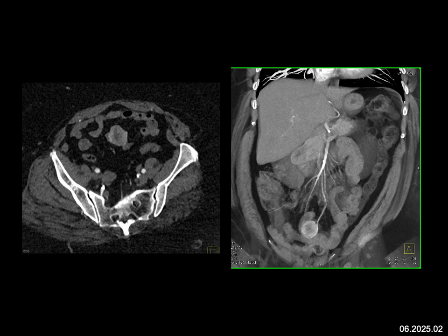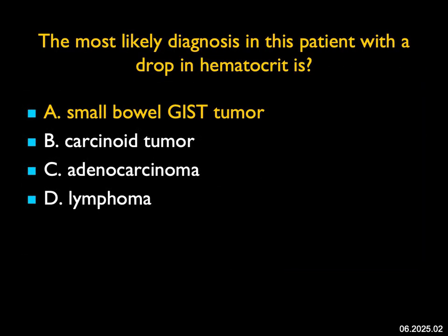Adenocarcinoma is just too vascular for an adeno CA. Lymphoma can give masses in the mesentery, but usually they're large and multiple, not a solitary two-centimeter mass. A lesion like this adjacent to bowel — you've got to be thinking about a GIST tumor. GIST tumors can have feeding vessels, they're vascular, they're smooth-bordered, and when they get large they can ulcerate. The stomach is the most common area for a GIST tumor, but small bowel is second most common. This was a GIST tumor of the small bowel.